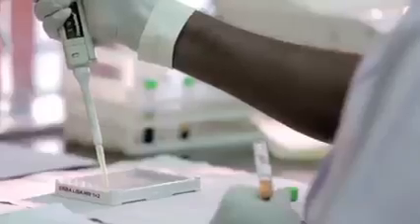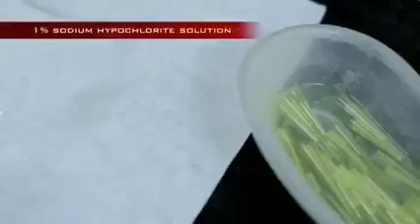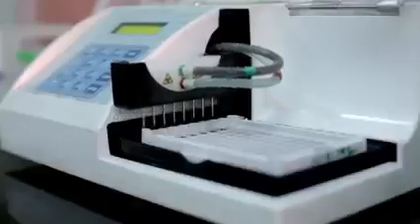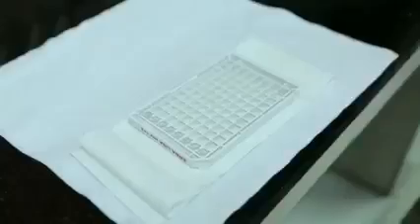Make sure that tips are changed after dispensing each and every sample. Discard the tips in a kidney tray containing 1% sodium hypochlorite solution. Then incubate the microplate at temperature and duration as instructed. Now, wash the microplate using ELISA washer as per kit literature. Invert the plate over a tissue paper and dry it by gently tapping. Then add enzyme conjugate and incubate again.